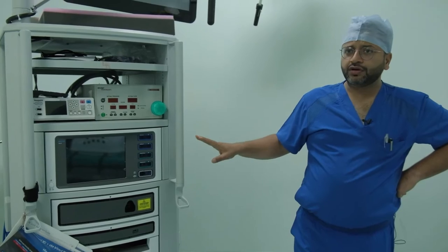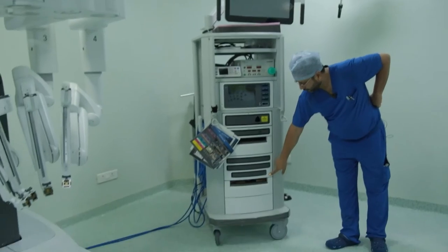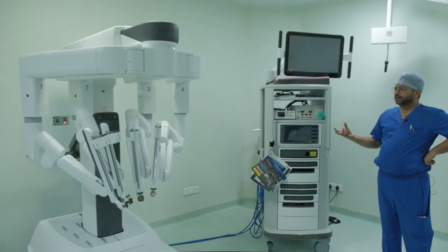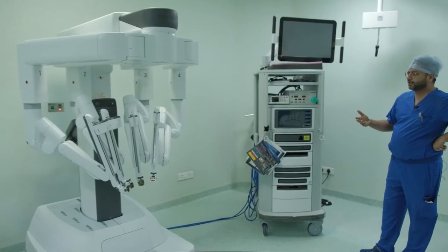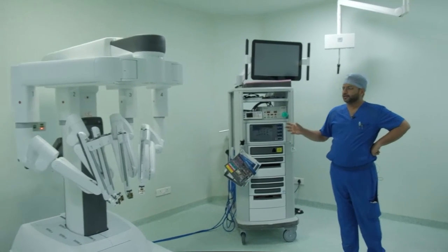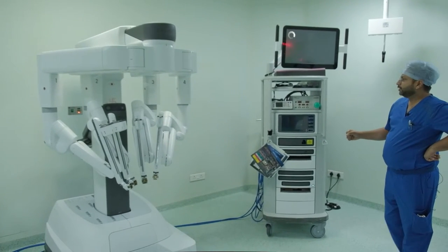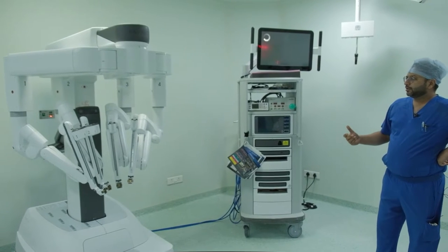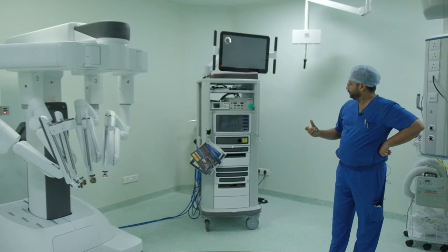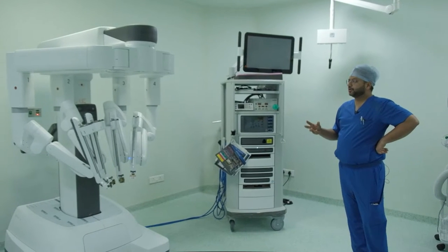Now as we switch on the system, it is going to integrate itself using these fiber optic cables. We press this button to switch the system on. Then there will be self checks which are going to happen in the patient cart and the surgeon console, as well as the vision cart. All the three components get integrated using these blue fiber optic cables which you are able to see. The important safety checks happen at this time. The system is getting switched on, and the integration of the three parts is one of the most important components.